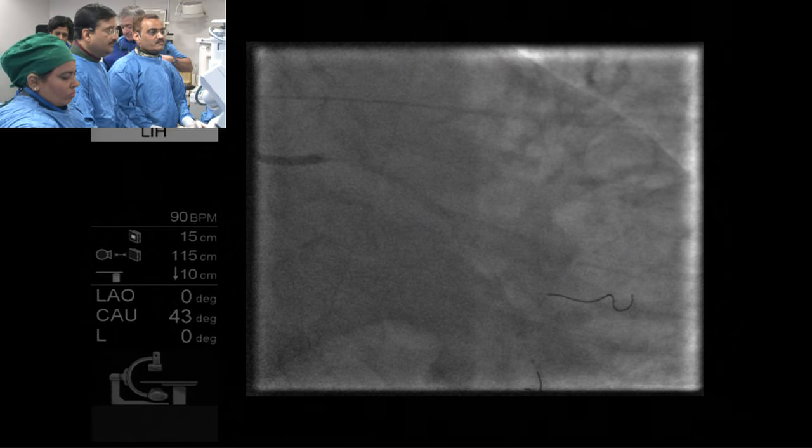This is all the debate, all the studies about bifurcation stenting, one stent technique versus two stent technique. Which one's better? So what do you think? The audience, any suggestion what he should do? He's open to any suggestion. Tejan is very good at that. 2.25 by 8 or 12, any company. Like we practice, you know, MACE and MICE. Jamal, I have some 2.25.